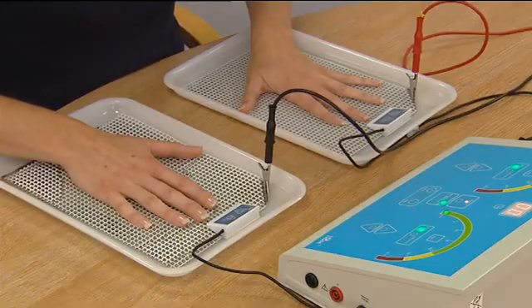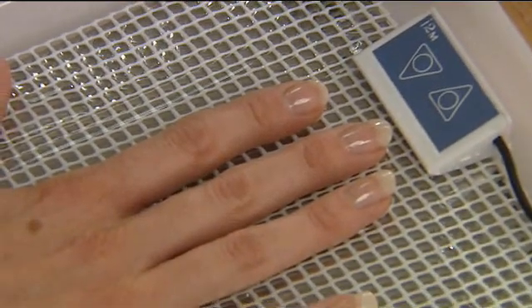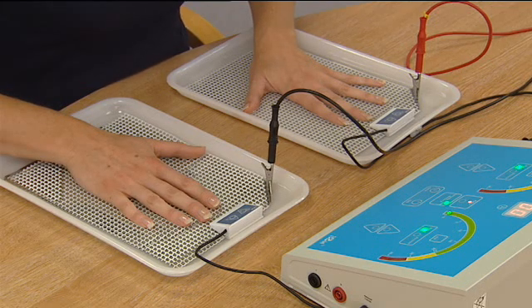This treatment should not be uncomfortable. During the early sessions, the sensations may become difficult to tolerate. Do not persist in maintaining any uncomfortable level. With repeated sessions, the skin will thicken, and the current can be pushed towards, but never beyond, 20mA.